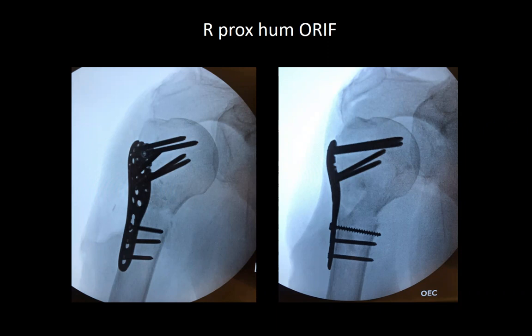So you have a surgical neck, right? When it collapsed into varus, you put it out where it's supposed to be. So now there's that medial gap you have there. So what's going to happen now? It could potentially fall again, back into varus. So how do you prevent that with your implant? Usually you put a calcar screw in immediately. And where do you put all your screws? In the subchondral bone. Yeah, as far as you can go.